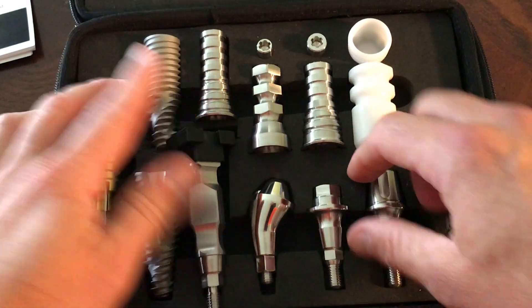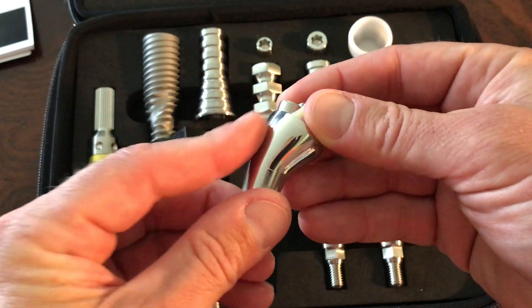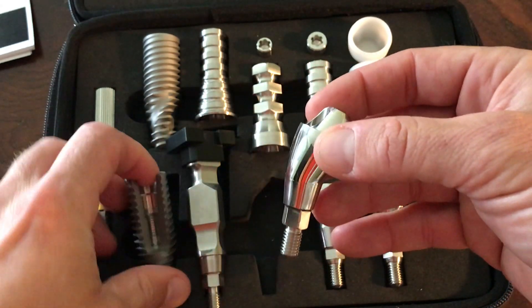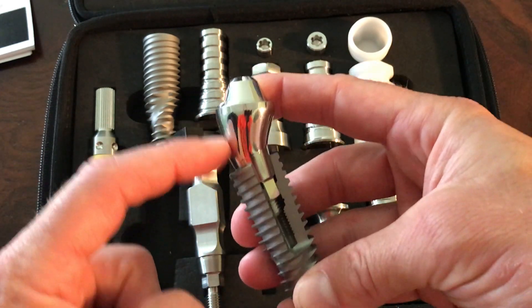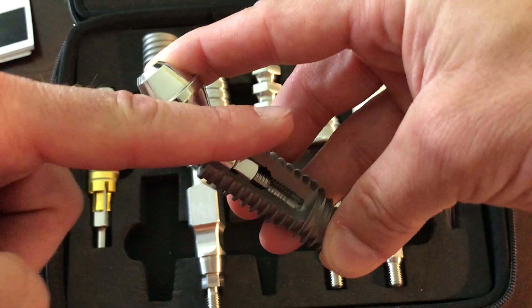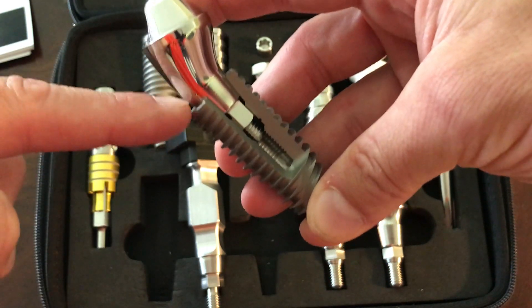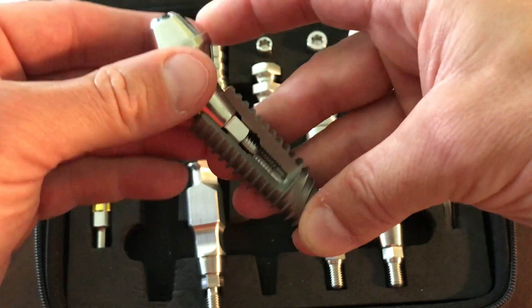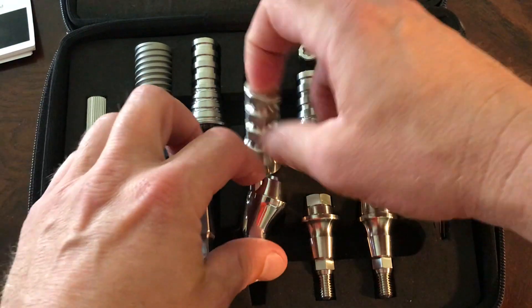Way better for the restorative compared to what we had previously in the CM connection. I like that subtle enhancement to the design. Even in the multi-unit abutment they made this edge a little bit more rounded — the thought is that we don't have to use a bone profiler as much to remove bone on the distal aspect if our implant is placed on an angle, and we don't need to chew this bone down to seat our abutments properly.